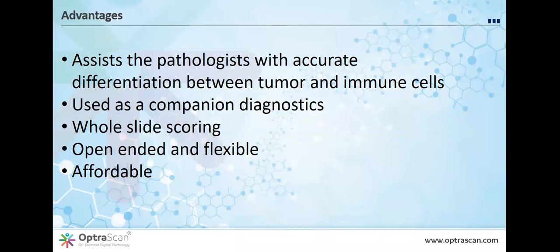The next question might be for you, Dr. Taylor. What are the different immune cells that are counted? They vary in size. Yeah, well, they do. Your morphology is a wonderful thing, isn't it? Because people that don't do morphology, including most of our clinical colleagues, think that the answer's black and white. The answer's 221 versus 119. And it's nothing like that. And we all know that. It's a matter of experience and training and evaluating what we see.